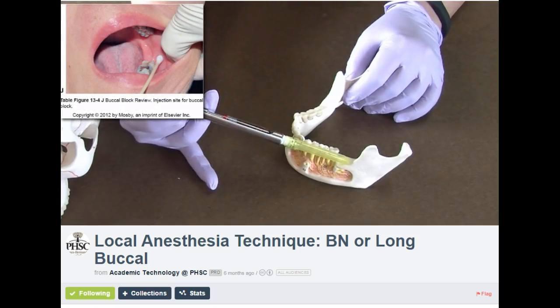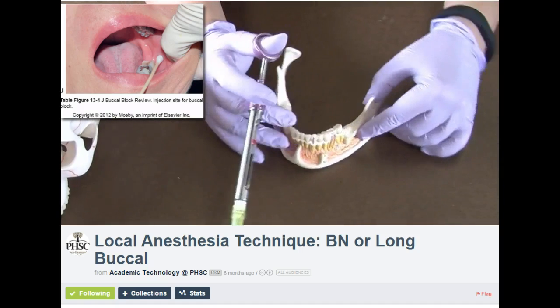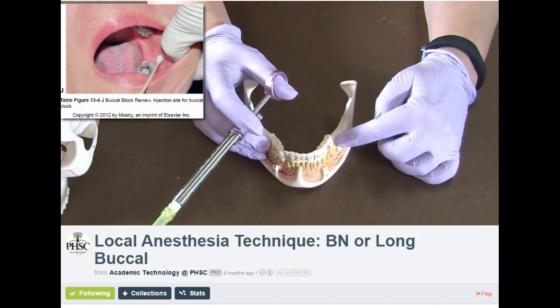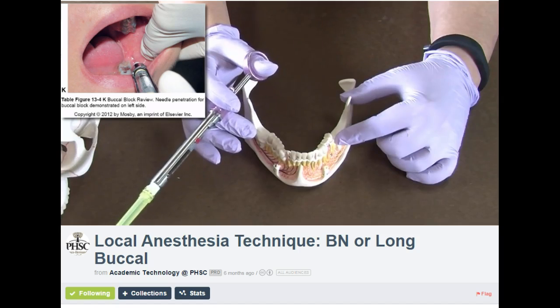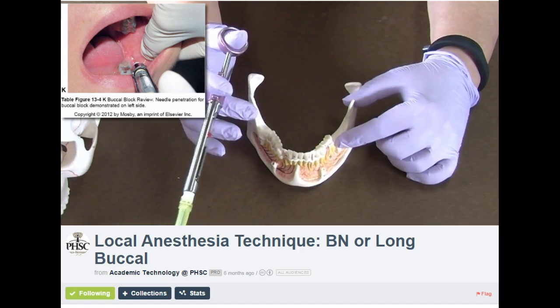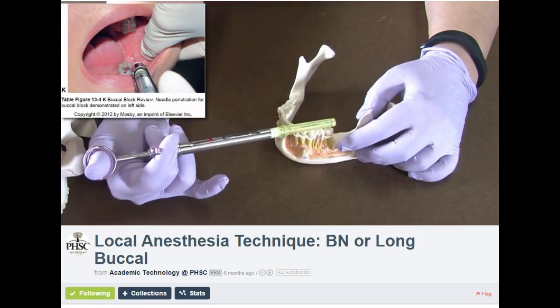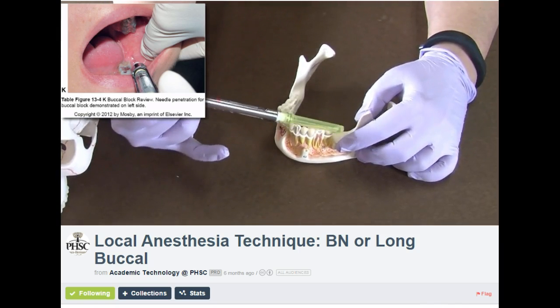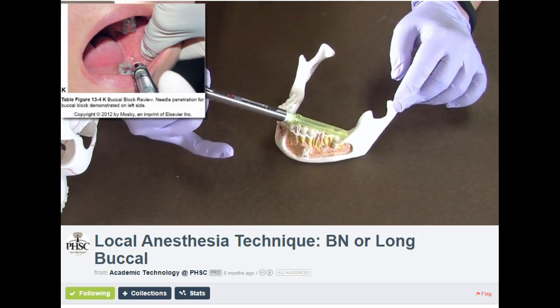The landmarks for the Long Buccal are the most distal mandibular molar and the anterior border of the ramus of the mandible, which is right here. This is your landmark — the most anterior portion and the most distal molar. So you go in the vestibule, distal and buccal to the most distal molar in the quadrant at the height of the occlusal plane. You want to be parallel to the occlusal plane and go into the most lateral and most distal portion and deposit your anesthetic there.